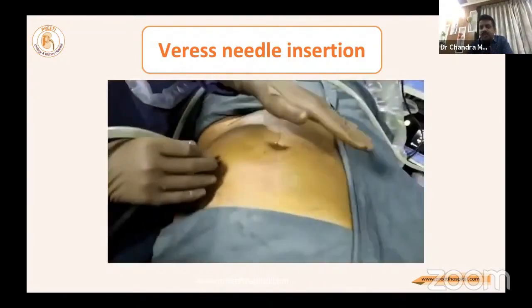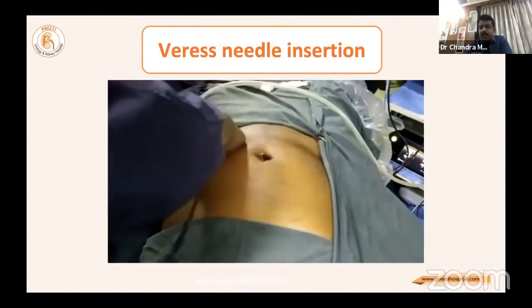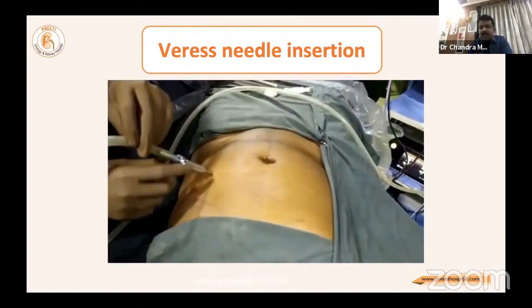Then uniform distension. First thing you have to see is the hypochondrium. Tap it, immediately gas will go there unless the patient is in extreme Trendelenburg position. You will not do the position unless the pneumoperitoneum is done. So the hypochondrium on either side is the first thing you have to tap.